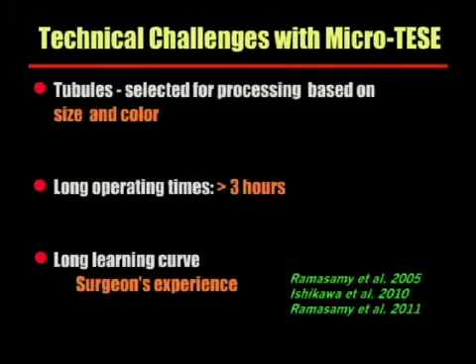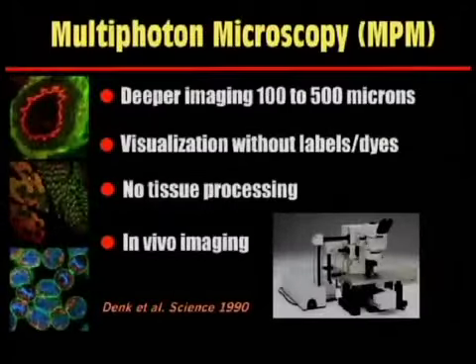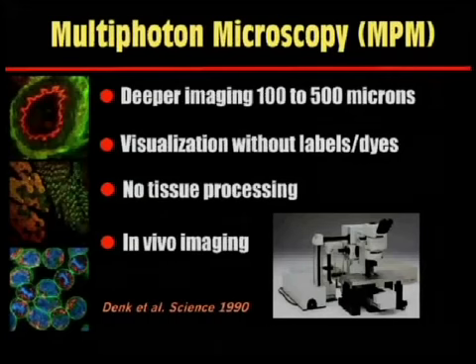MicroTESE has some technical challenges. The tubules that are selected to be extracted are based only on characteristics such as size and color. The operation requires long operating times and requires a long learning curve coupled with surgeon experience.